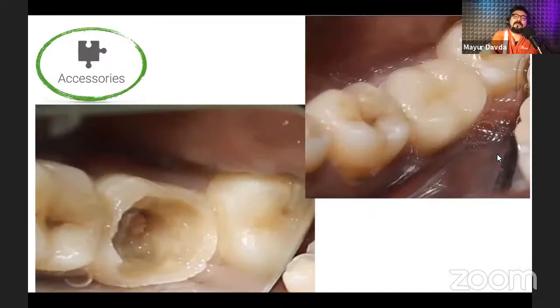Now, the reason why I reinforce a lot on front surface coated mirrors all the time is so that the participants do not get images like this. Now, I'm going to annotate once again, and I'm going to use my arrow key, and I'm going to show you that this particular image has a ghost image. If you can appreciate this, please put it in the chat window. So there's a real image over here. You can see there's a real image of the tooth, and there is a ghost image around the tooth as well, which looks like a halo around the tooth. If you can appreciate it, I hope you can, but I surely can, at least on my desktop or my laptop. But this is basically happening because you have used the wrong mirrors.